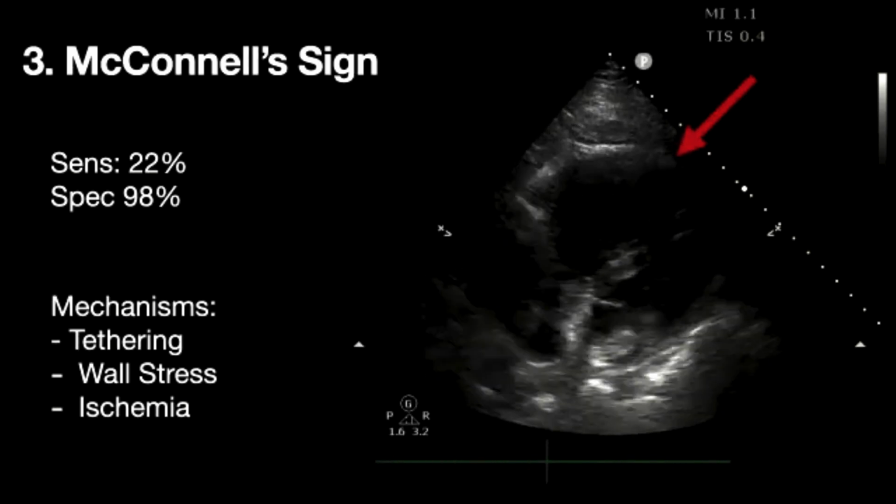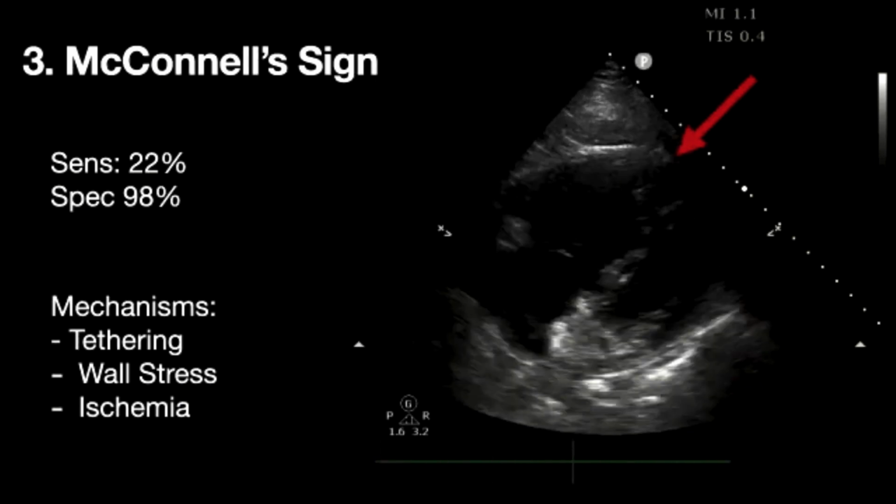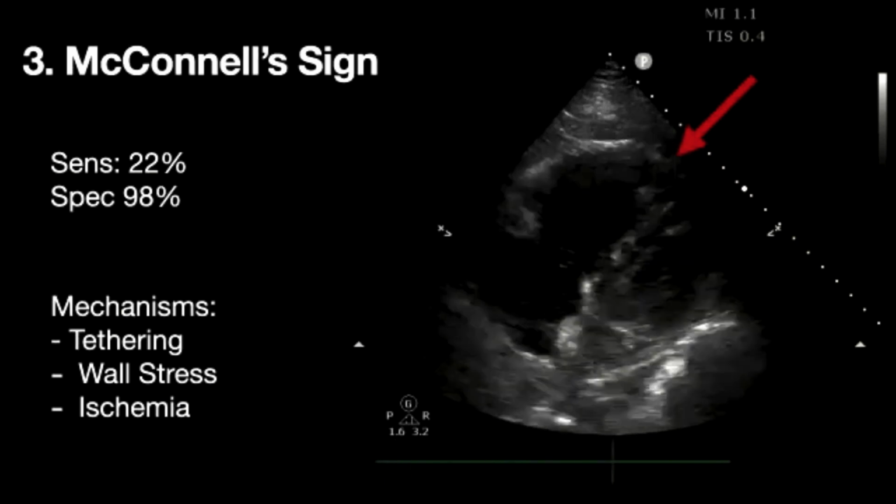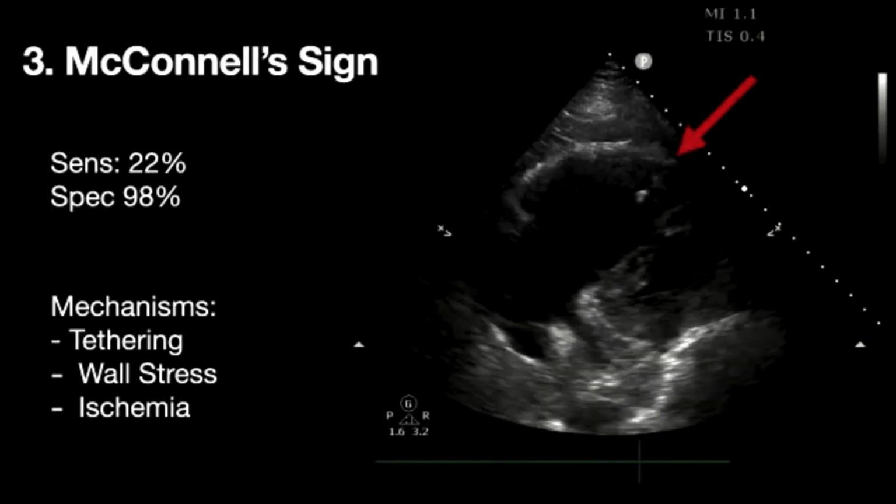Cool, thank you. So with this foundation in mind, we talked a little bit about the physiology of what's going on. We talked a little bit about the 2D findings. I want to introduce this idea and then let Ashish go and talk about it, about another sign that you'll see in this paper that we introduced at the beginning, called the 60-60 sign, right?